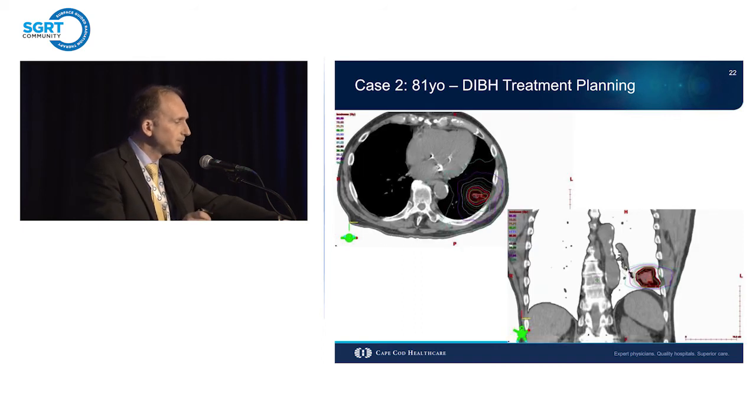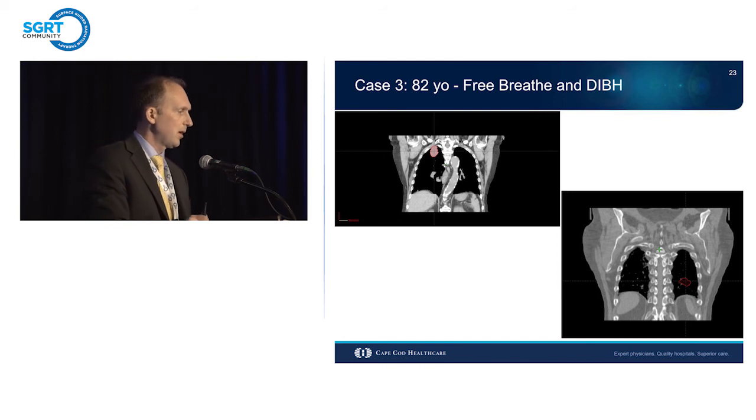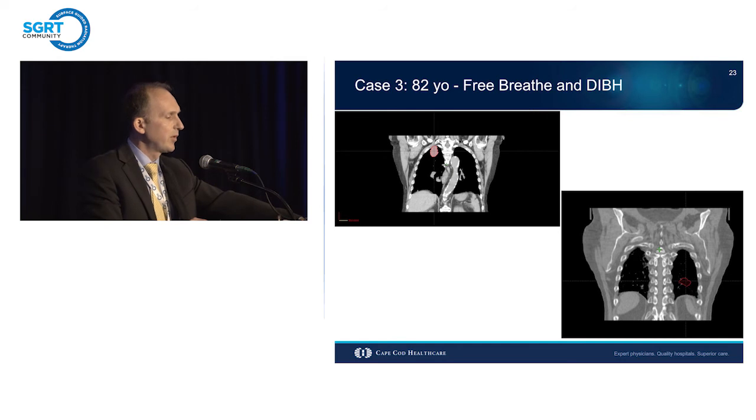Here's another one. And then here's an interesting one. Just before I came here, this person had 2 lesions, one in the right upper and one in the left lower lobe. So he was treated for both of those lesions, 5 times 10 gray, on the same day, in the same session. I believe we did the breath hold first and then the free breathe. And I tell you what, 40 minutes probably, and both of these were done. So that's pretty amazing, just cutting back on the imaging time and relying on Align RT so heavily.